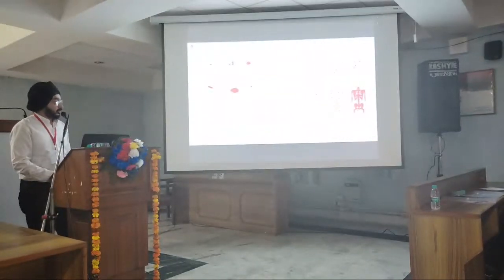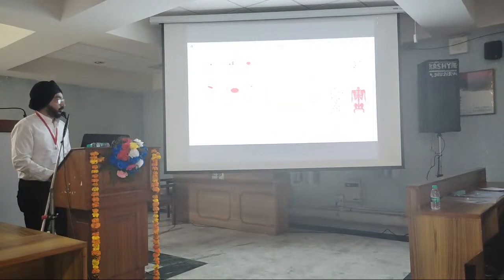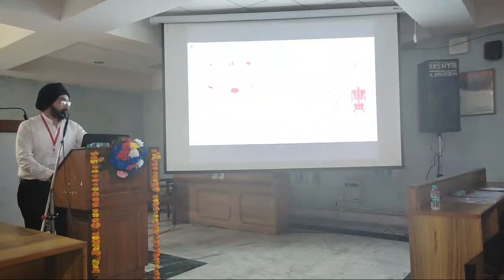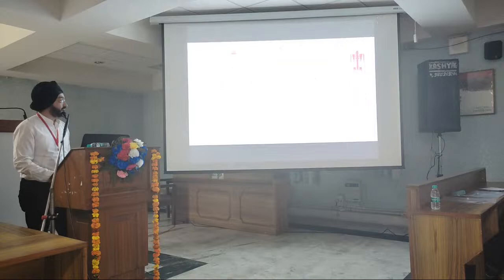So this is the algorithm that has been devised for reporting of PSMA PET. You basically divide the prostate into 6 quadrants, 6 areas, and you can get unifocal or multifocal involvement of both lobes. Seminal vesicle involvement, bladder involvement, or rectal involvement can be seen. Small nodes can be seen. Oligo or distant metastatic disease involving the lungs, liver, bone, whatever. All the sites can be seen, although sensitivity may vary a bit in soft tissue metastasis.